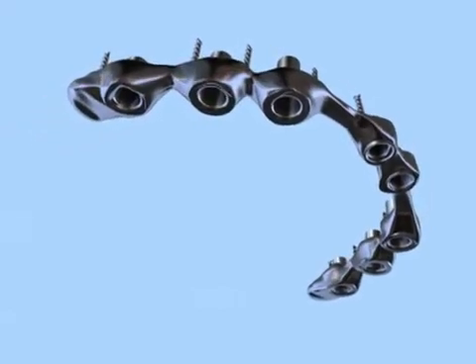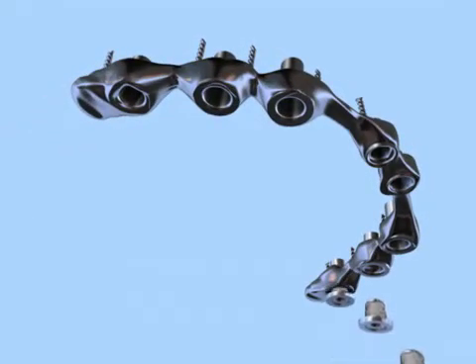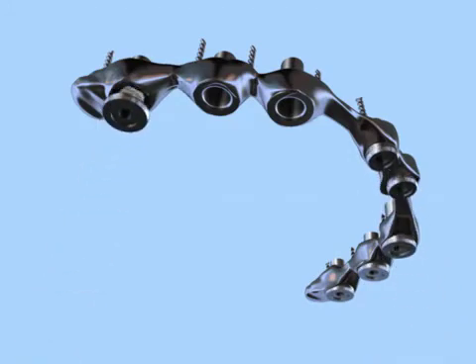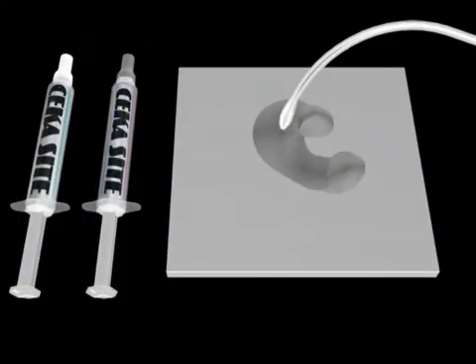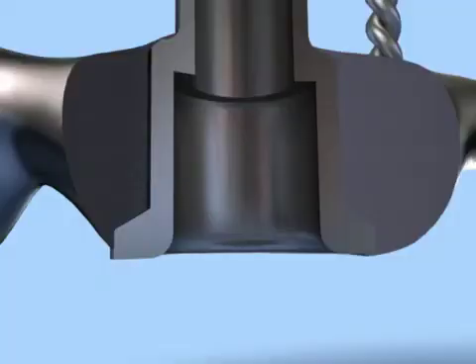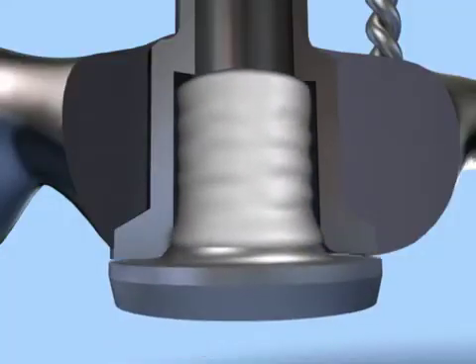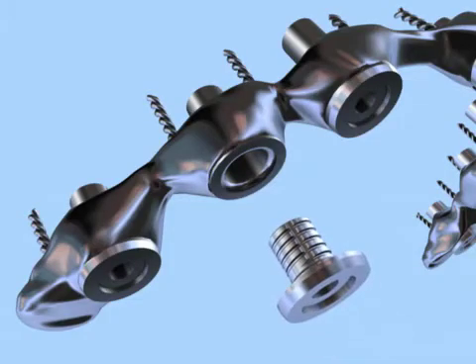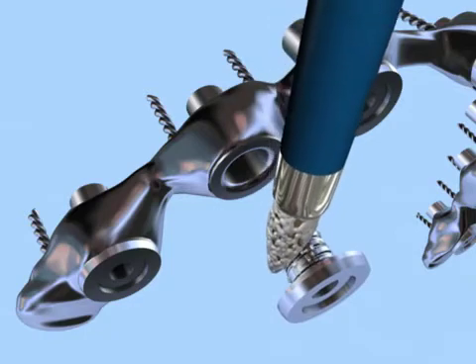We are now ready to cement the Flat-1 titanium cylinders onto the cast framework. The titanium cylinders are cemented with a composite resin cement, such as CicaCite from Cica or UltraBond by Kulzer. Note that the titanium cylinder is slightly smaller than the brass cylinder. This creates a space for the composite resin cement. Each cylinder is painted with resin cement and inserted into the framework.